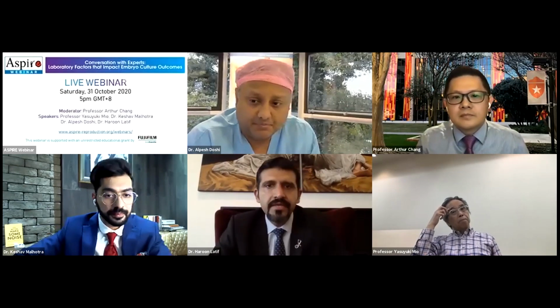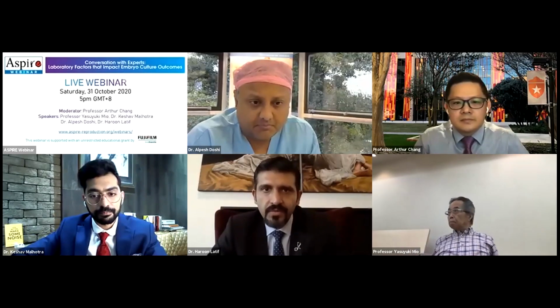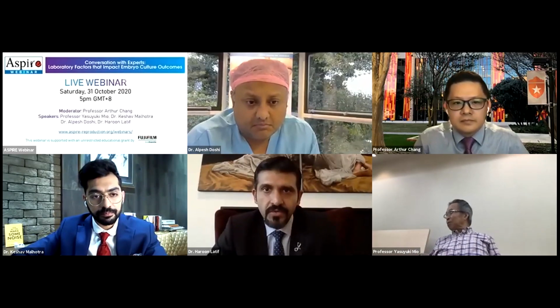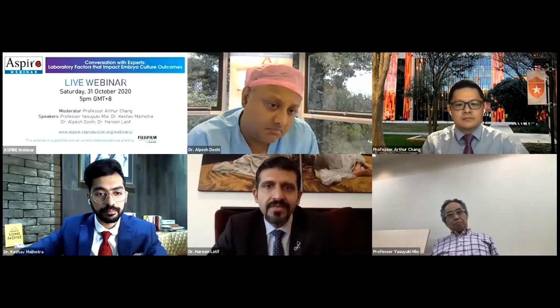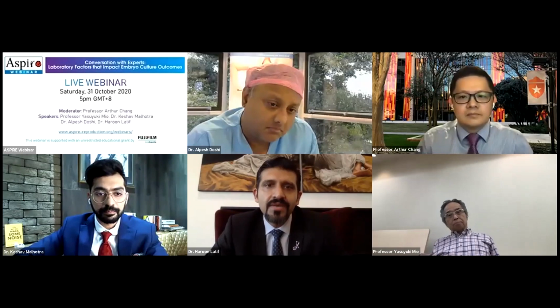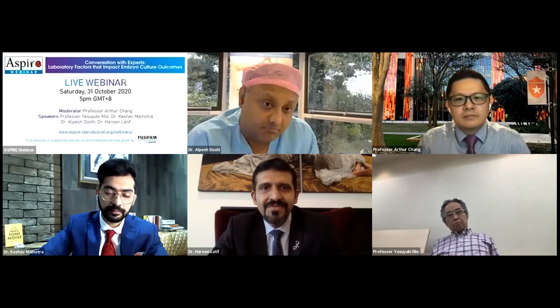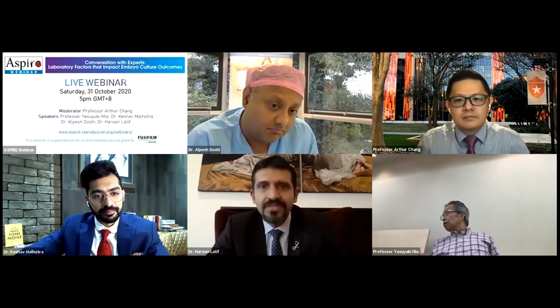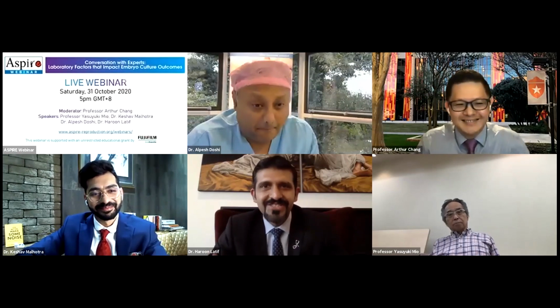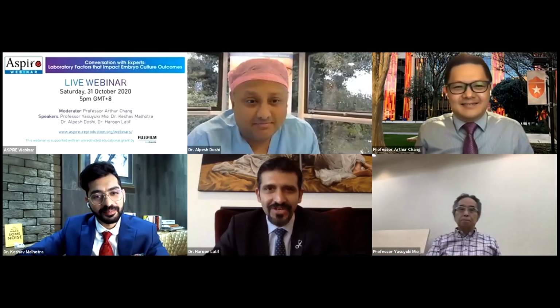I agree with both Alpesh and Keshav that waiting is better than going in early. However, there's a concern, which is that it can be workload driven as well. At times there's so much workload on the embryologists that they really want to just close the case, freeze it, transfer it, biopsy it, whatever needs to be done, so that they can move on to the next case.